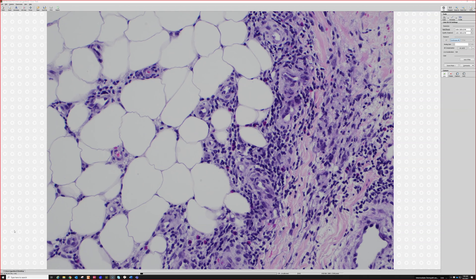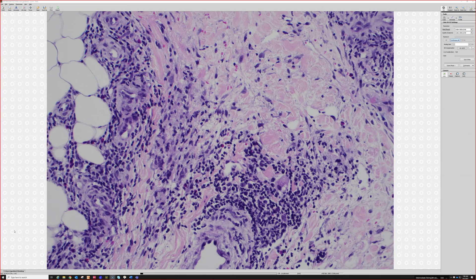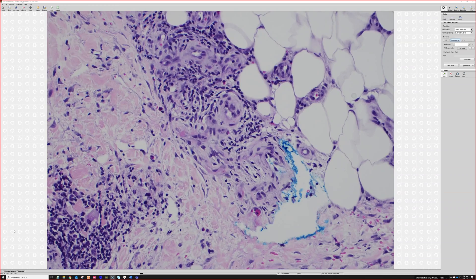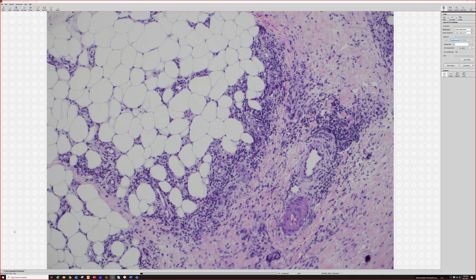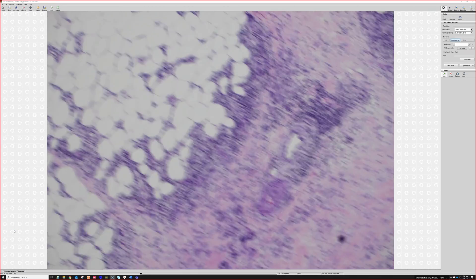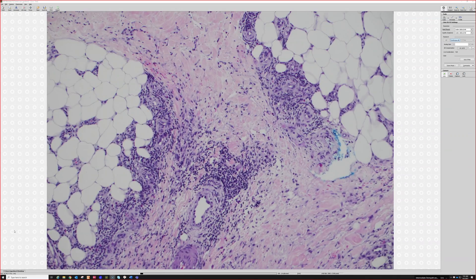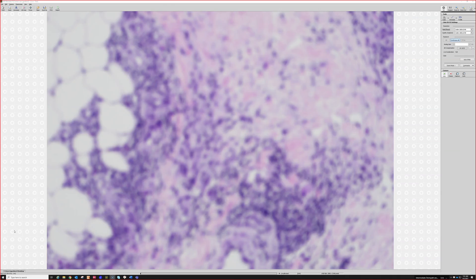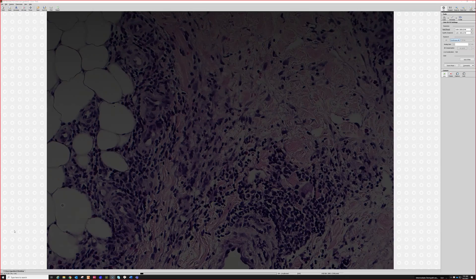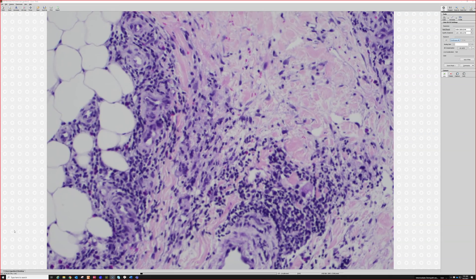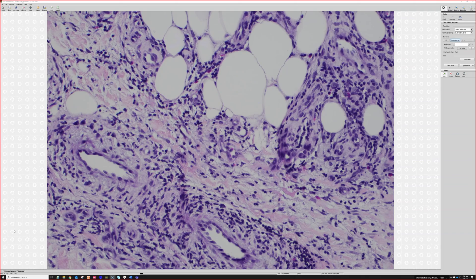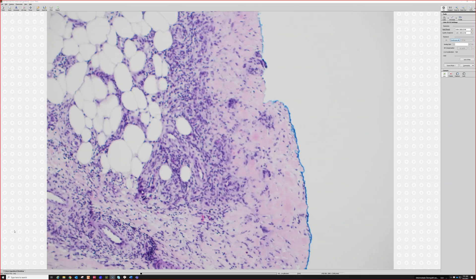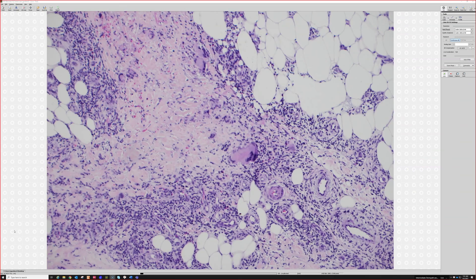Septal versus lobular paniculitis is not a perfect clear-cut line in my experience, but it works the most here. This is a nice example of the changes you'll see in the septa of the fat in erythema nodosum. Some of these little granulomas — people have called them Miescher radial granulomas, if you like buzzwords. There's a little granuloma right here.